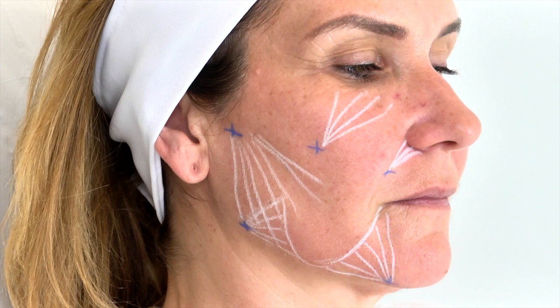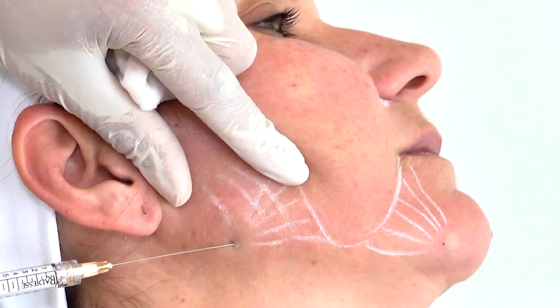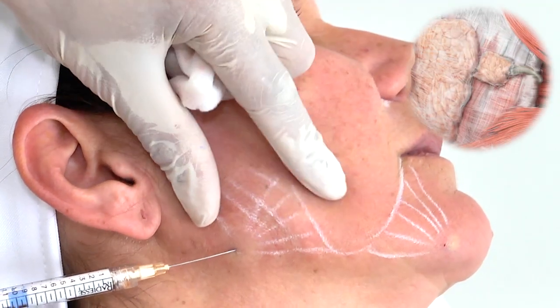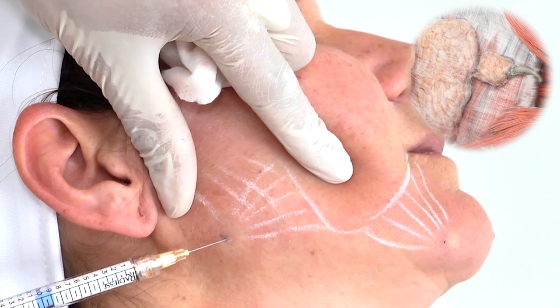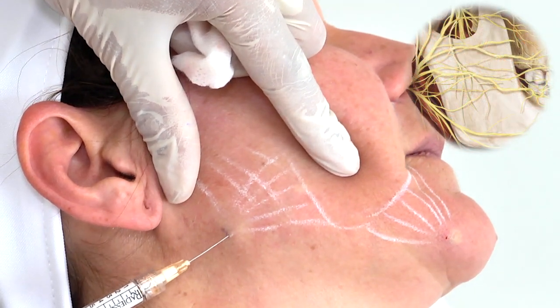The injections are made along the length of the notch opposite the inferior face of the mandibular bone using a tight fanning technique. Then the adjacent lines rise up to connect with the marionette lines by subtending the fold below. After disinfecting, make a pre-hole with a needle across from the mandibular angle point to the dermic-hypodermic junction and insert the cannula parallel to the cutaneous plane in the desired injection plane.